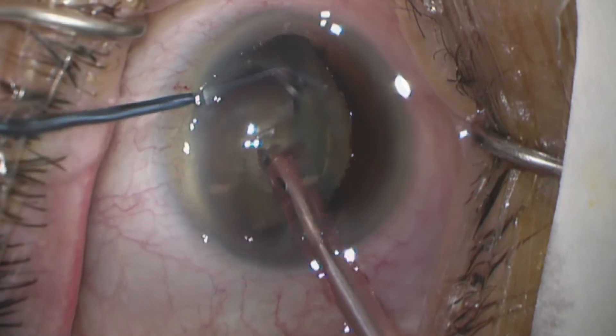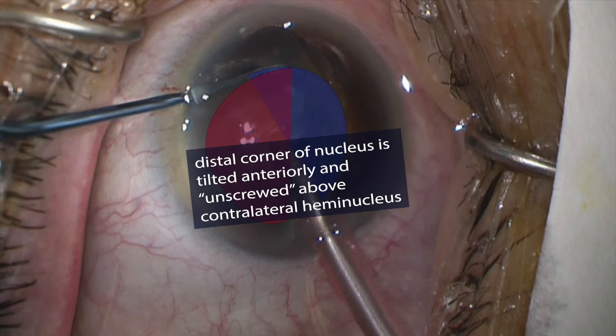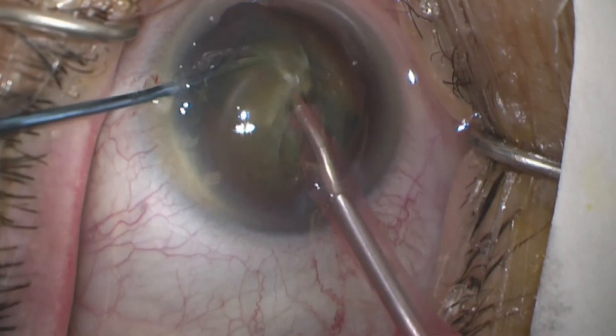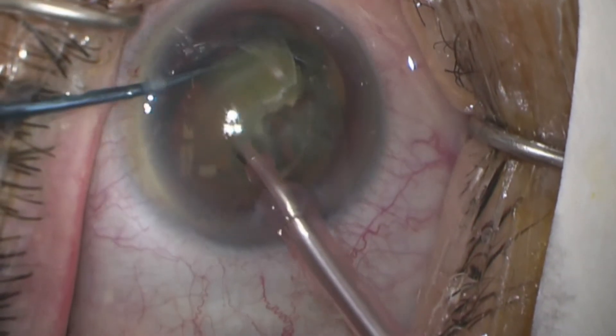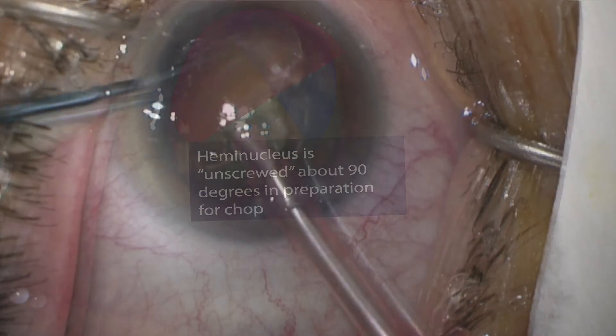Now the embedded corner is depressed toward the optic nerve to prevent snagging on the rhexis, and retracted to the main wound so that the edge of the nucleus clears the edge of the rhexis. Now we tilt the retracted corner of the lens upward toward the cornea and unscrew the hemi-nucleus anteriorly for 90 degrees so that a quarter of the nucleus sits atop the opposite hemi-nucleus. This usually means reacquiring the nucleus once with the phaco tip to complete the 90 degree turn.